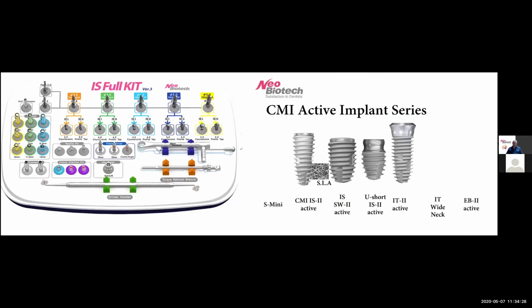Most of my cases, actually practically all of my cases, are with the Neobiotech IS2. This is a kit that we've been using, but I know there are more advanced kits and newer design kits that are available.